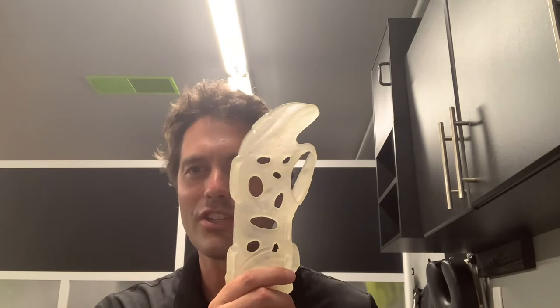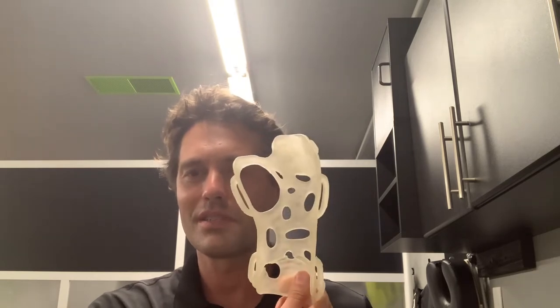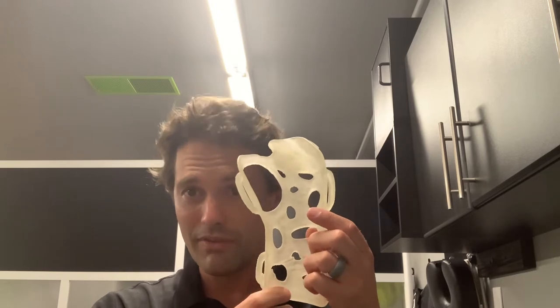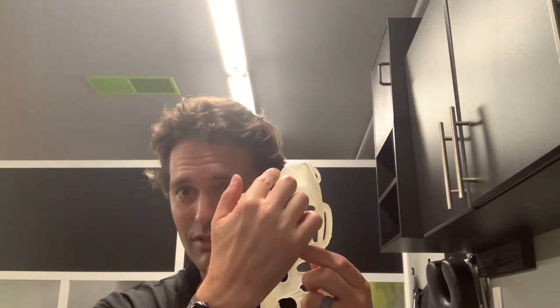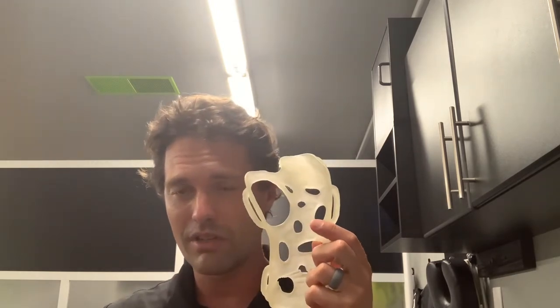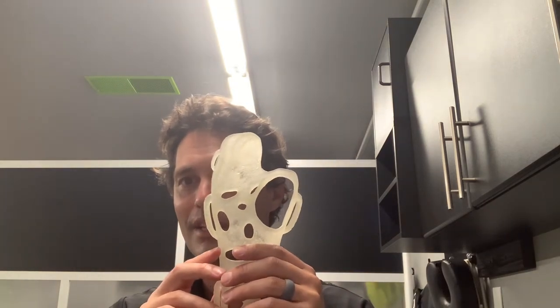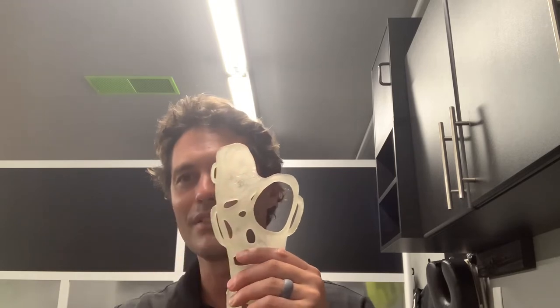Hey everyone, so I got a lot of questions about how you make changes to the 3D printed splints. I just wanted to show you this one where the finger was a little too wide here — the finger placement was off, so I just needed to shave that down so that the fourth and fifth digit would contact but not the third.